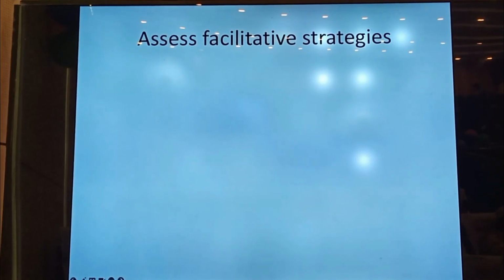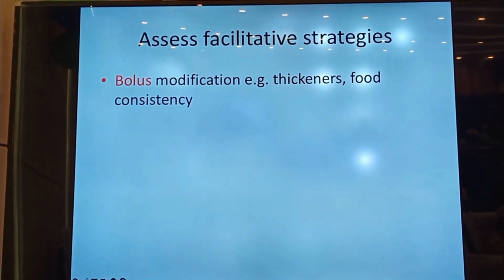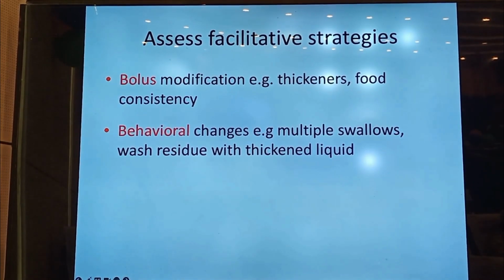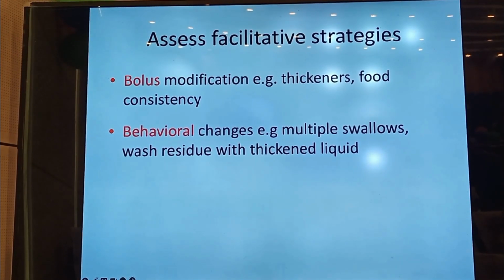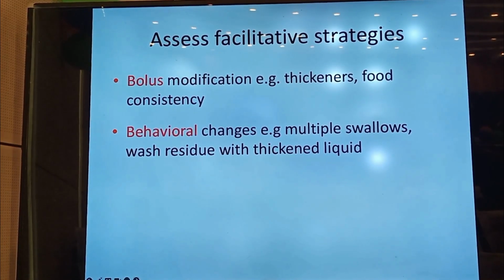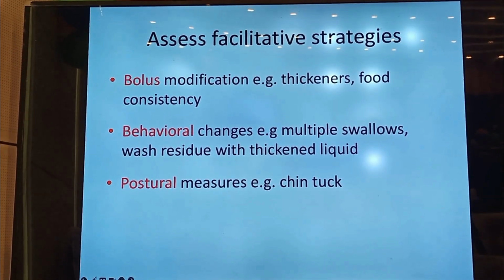It can be useful to assess facilitative strategies. What are facilitative strategies? These may involve altering the consistency of the bolus, changing the swallowing behavior of the patient. So for example, they may be asked to undertake multiple swallows, or sometimes they have to wash down food residue with thickened liquid. They may be asked to do postural measures such as chin tuck.